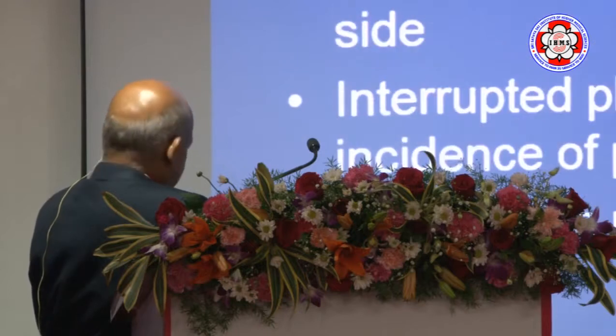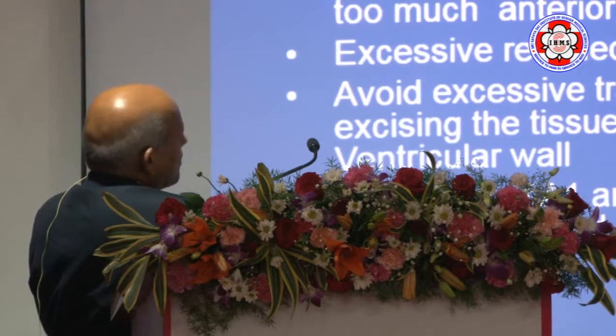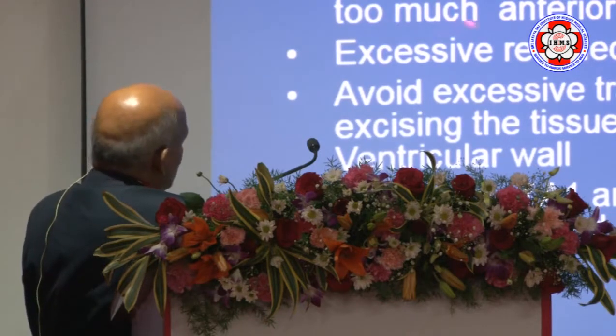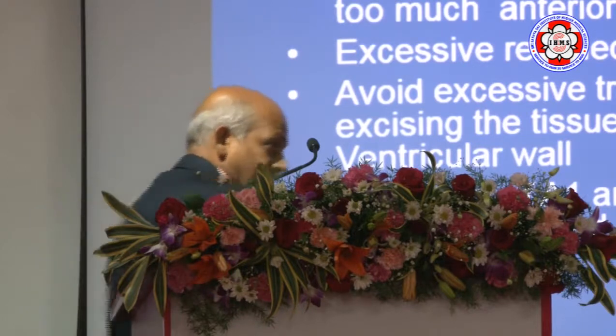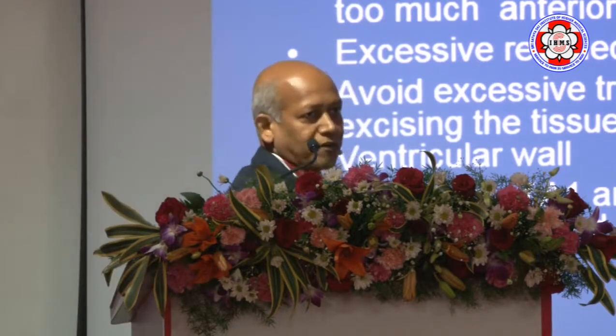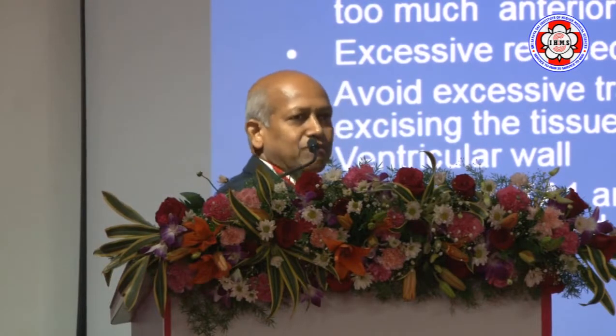If the leaflet is heavily calcified, cut it out, leaving the papillary muscle and a small valve tissue, which can be reattached to the annulus. Care must be taken not to cause LV obstruction by retaining too much of the anterior leaflet. In the beginning of my career in 1984, the practice was to leave all the valve tissues. I retained the entire anterior leaflet.